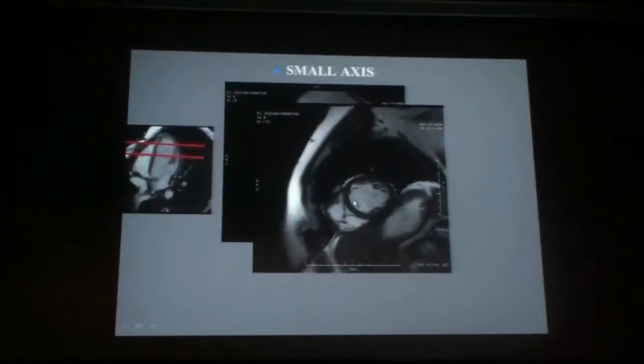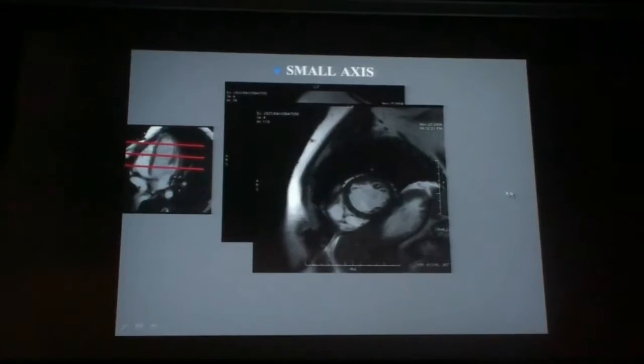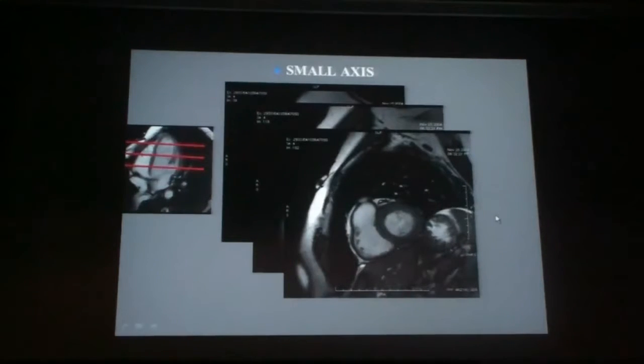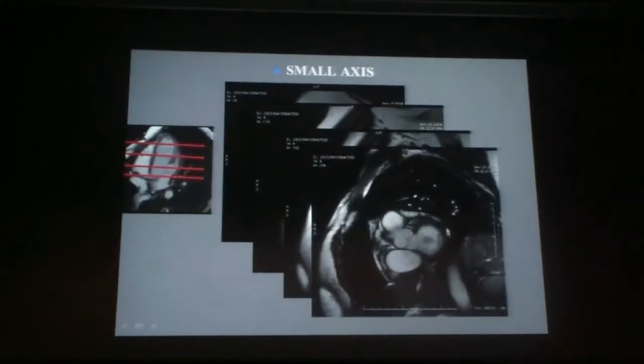Over here, the left ventricle, the right ventricle with a thin myocardium, which is different from the thick myocardium of the left ventricle, which is related to the low pressure of the pulmonary artery, which is not the case, of course, in the aorta. And then you go from the apex of your left ventricle to the base of your left ventricle, so that at one point you reach the mitral valve annulus and the origin of the aorta.